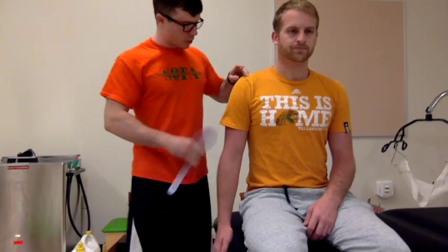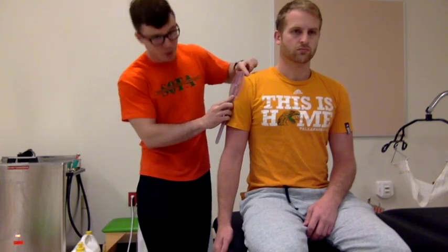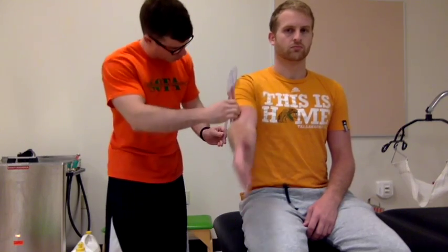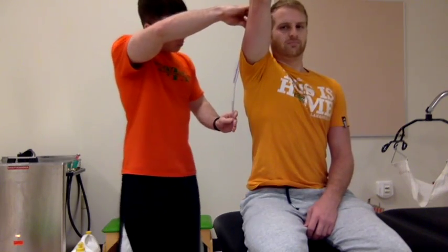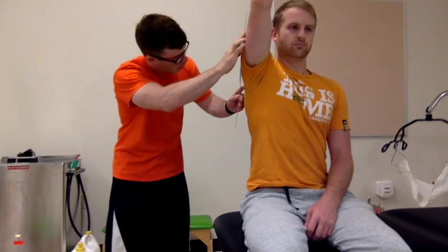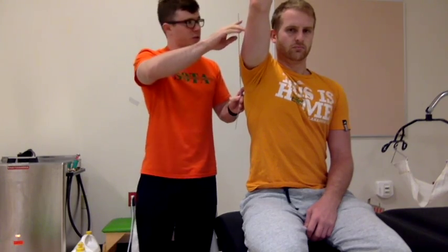First up is shoulder flexion. You will put the axis on the humeral head, which is 1.5 inches below the acromion process, which is right here. I'm going to need you to flex your arm. The stationary arm is going to be parallel with the trunk, while the movable arm is on the lateral epicondyle. And right here, we are looking at approximately 141 degrees.